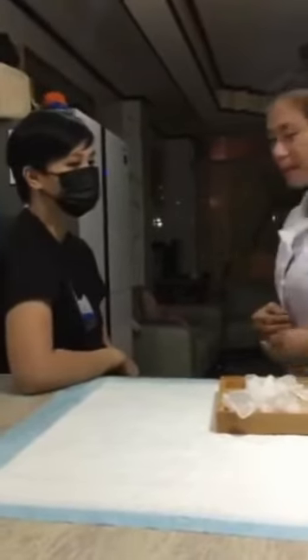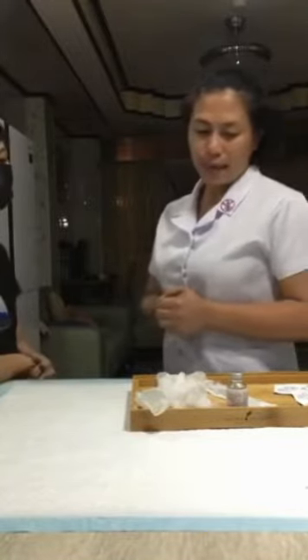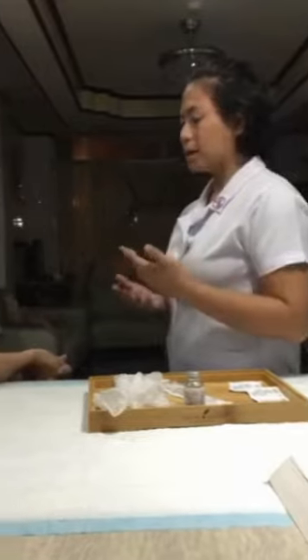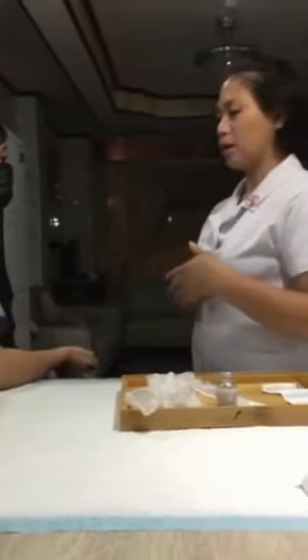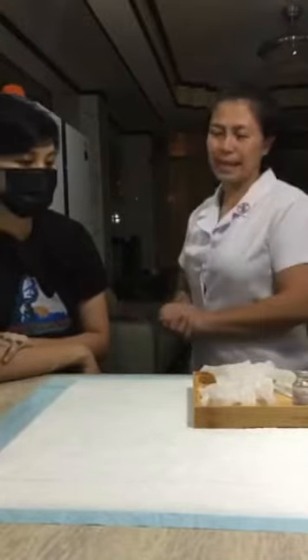Dominic. Hi ma'am, Dominic. Today I will be doing the skin test for you, and I will produce a small wheal. It's sometimes called a bleb. It is like a blister, so it might cause you pain, but it will just gradually be okay. I'll provide privacy for my client by closing the doors, drawing the curtains, and we'll begin.